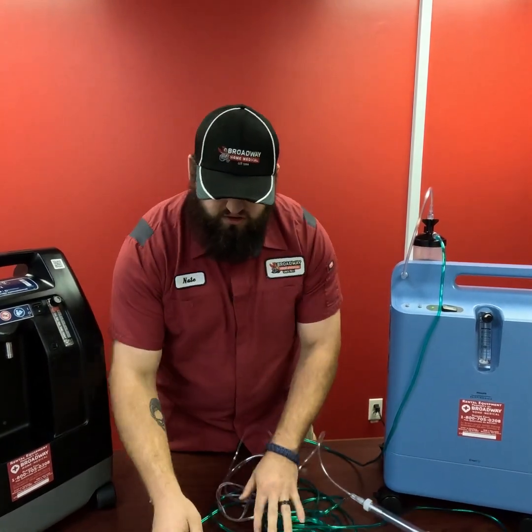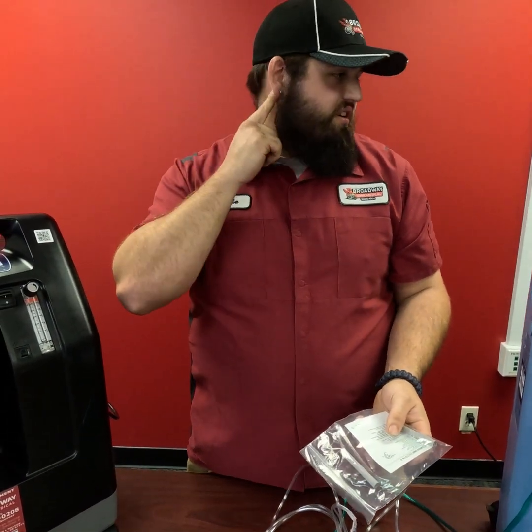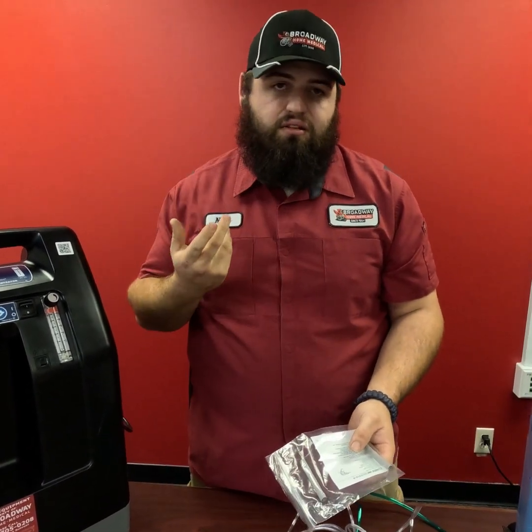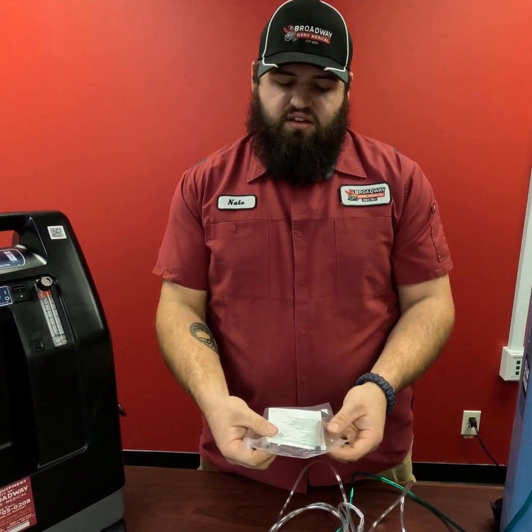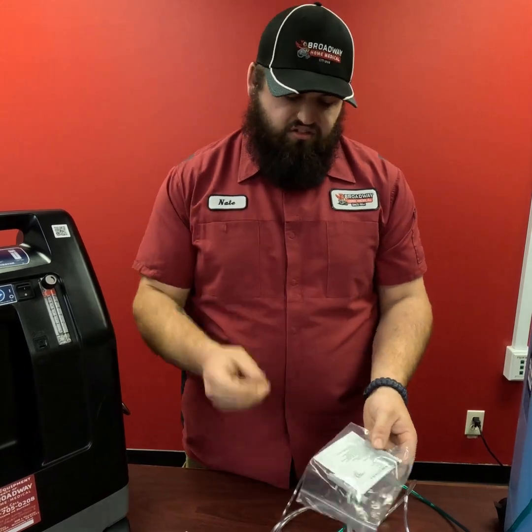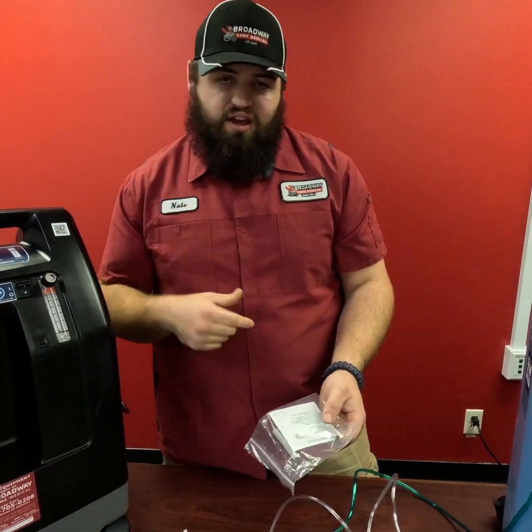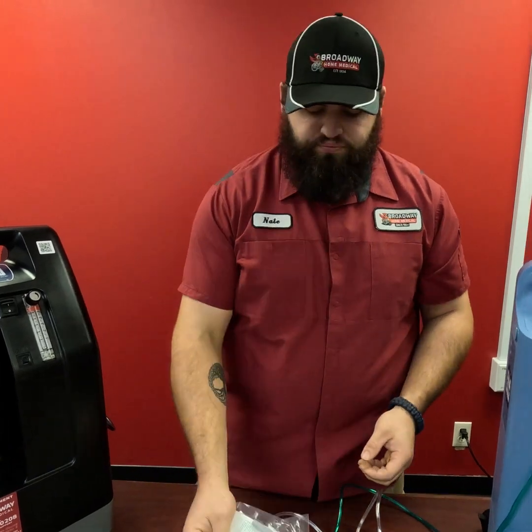Now there are some comforts we have for you. Sometimes folks who wear oxygen all the time will experience some ear issues, where that nose cannula rides on the ear a little bit. It can cause them to get a little painful there. So sometimes we can give out these little ear cushions. They'll just wrap around the hose down here and ride right up there on your ear, and it makes it just a little bit more comfortable to use.